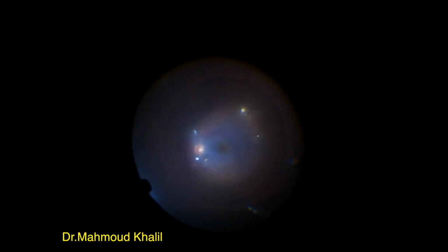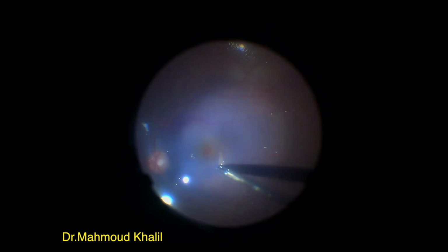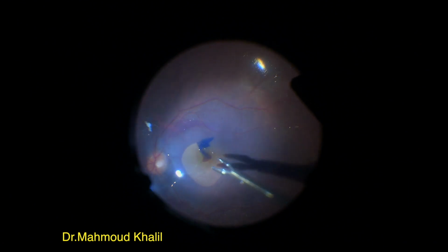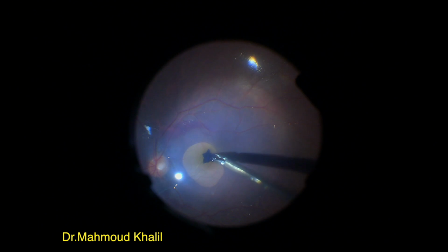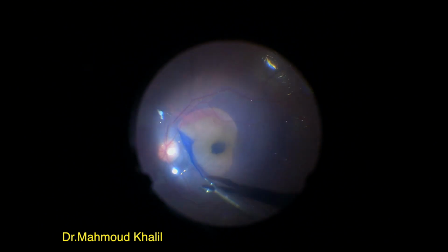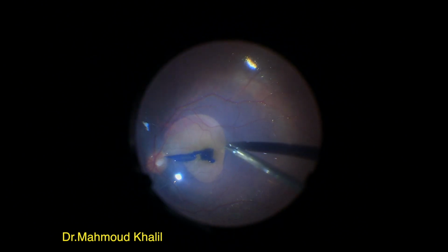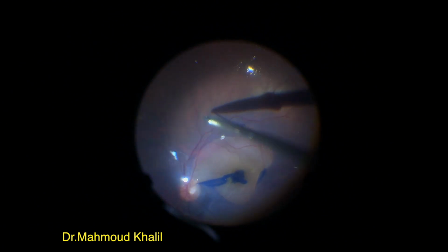In this case, I used perfluorocarbon liquid Decaline. The value of Decaline is to assist the ILM to be sticky to the macular hole, lessening the risk of losing the inverted flap. Doing ILM peeling, leaving a rim at the edge of the macular hole to cover the macular hole, then augmenting ILM flaps with multiple flaps. So if one is lost, the other flaps are working good.